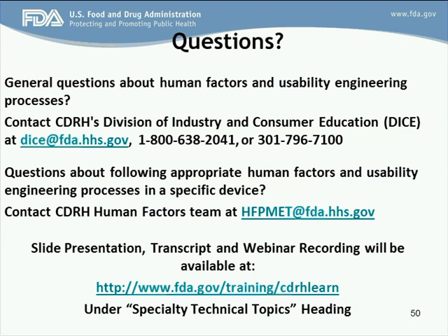Hi, this is Erin Keith. I just wanted to put this request for this type of testing and resubmission of information in context. You're still going to make decisions about when a specific design change to your device meets the criteria for submission to the FDA for reevaluation. And when that change meets that criteria, one of the things you want to consider is how it impacts your human factors data. If your human factors data is impacted, then that should be addressed in the submission: how you either revalidated it or determined that it didn't need to be revalidated.